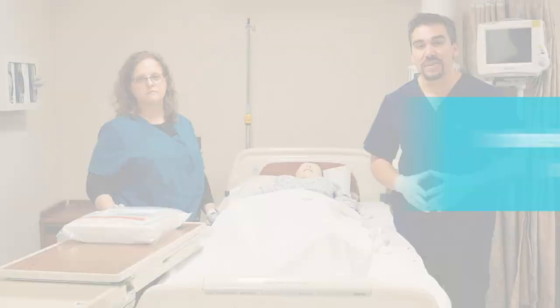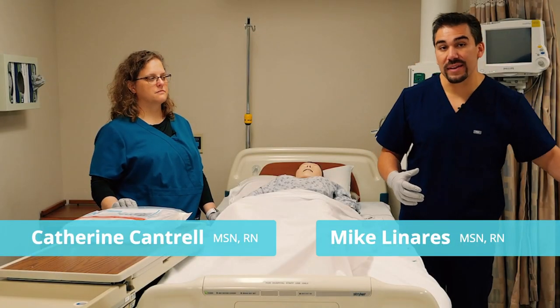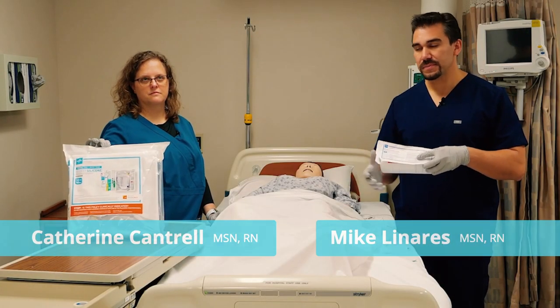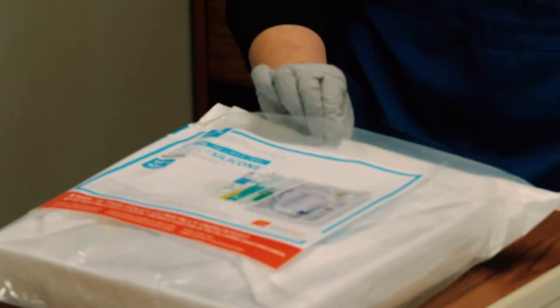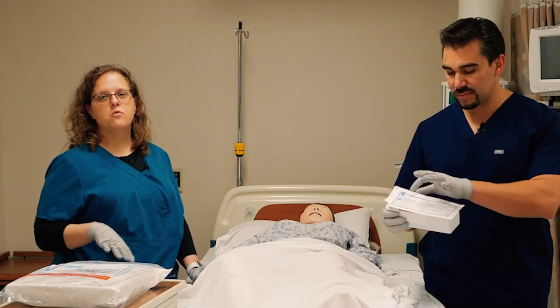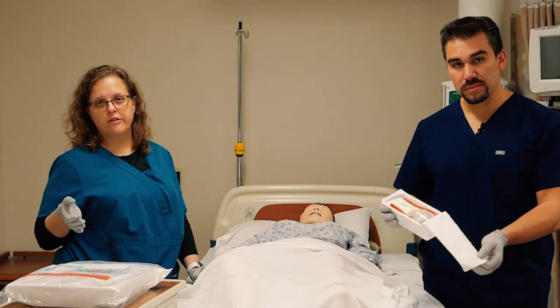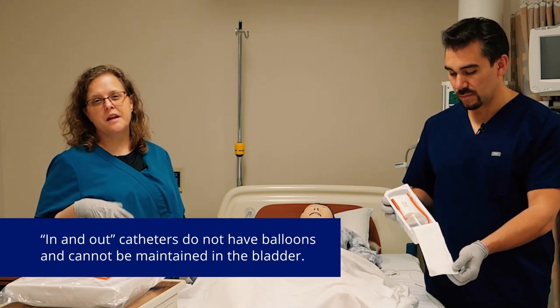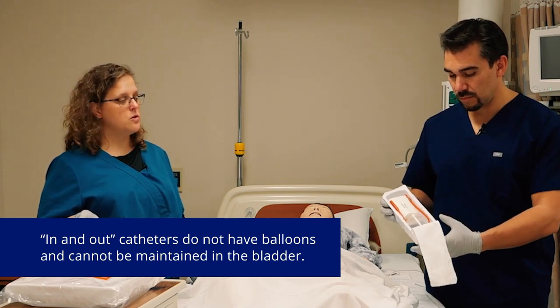Now we're going to talk about Foley catheters. We have an in-and-out catheter and also an indwelling catheter. An in-and-out catheter is just going to be for a patient who's got a little urinary retention that you expect to resolve easily, or if you just need a specimen and your patient's not able to give you one.